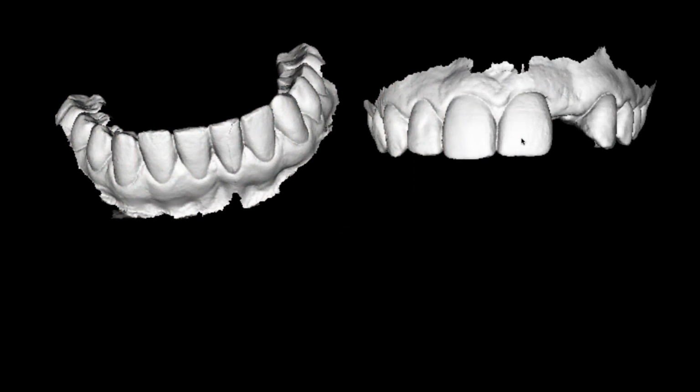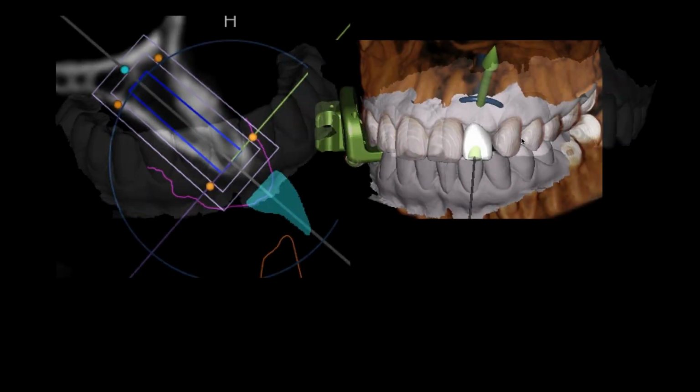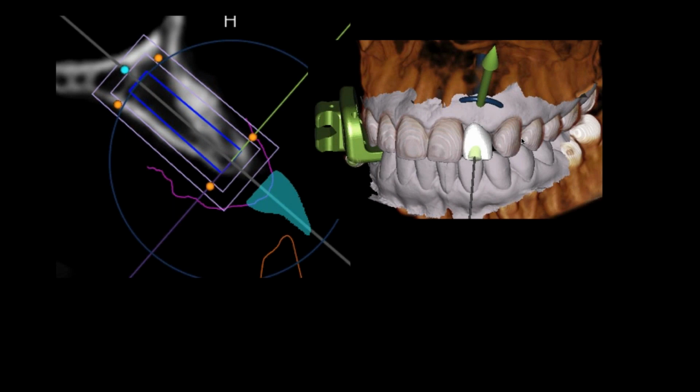But to make sure I get the workup done right, since I want to angle the implant for a screw-retained restoration, I get the intraoral scan. See, again, I'm scanning a lot of patients. 10 minutes a scan, 8 minutes a scan, depending on who's doing it. My assistants can scan them, I can scan them, it's whoever's available. So we just scan them, and there's no powder with this particular scanner, which is nice. Just dry off the teeth and you go to town. Very simple, very simple.